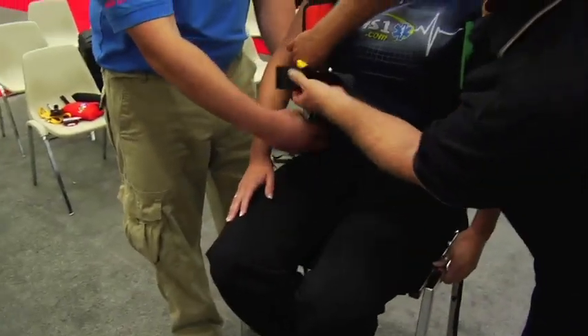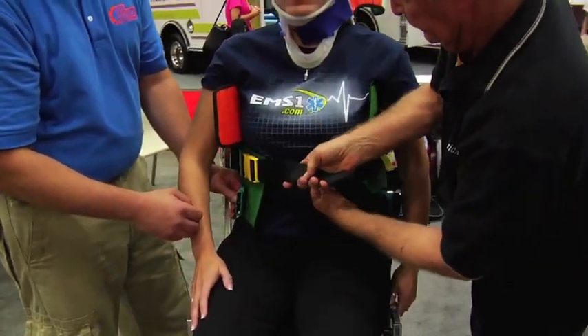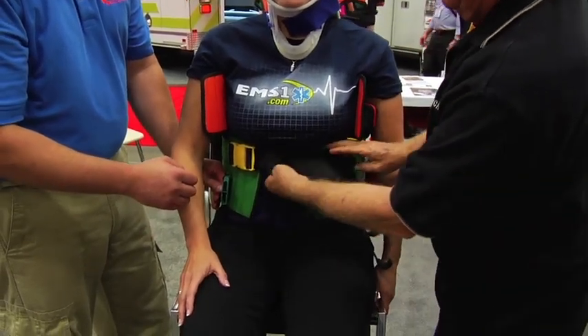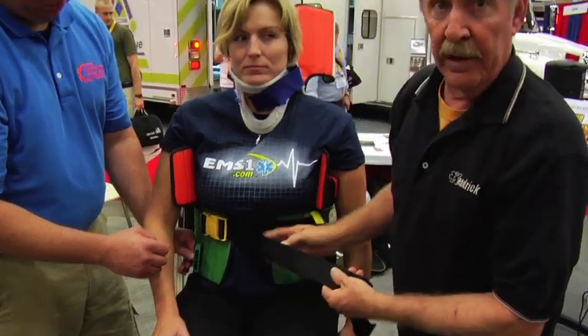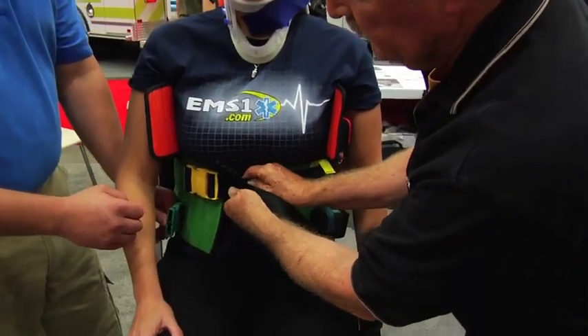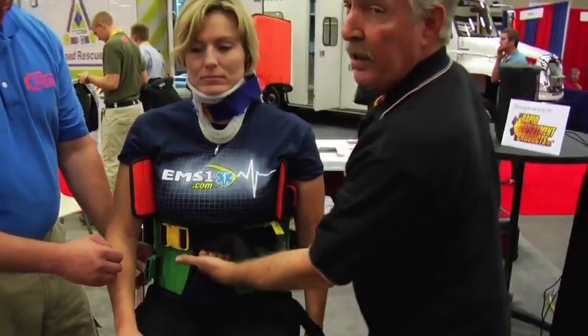You take the middle or yellow strap. One of the more important things to keep in mind is that if you feed this strap and pull, you take the tension off. It's really easy — if you just pull this, you can drag her all the way out of the car before you cinch anything up. Feed it towards the buckle and cinch. It'll tighten right up — just put it up into snug.